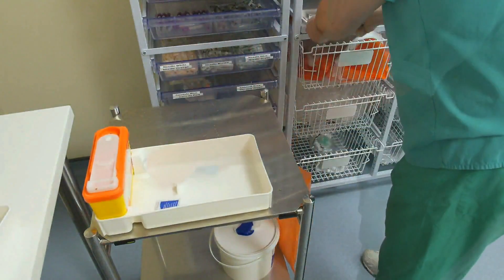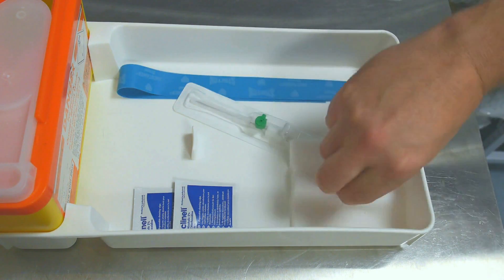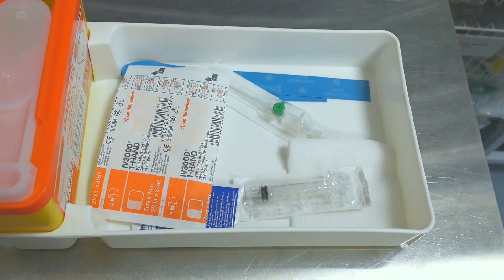Assemble all the necessary equipment for the procedure, checking packaging and expiry dates. Preparation is key and will ensure the procedure goes smoothly and without interruption.